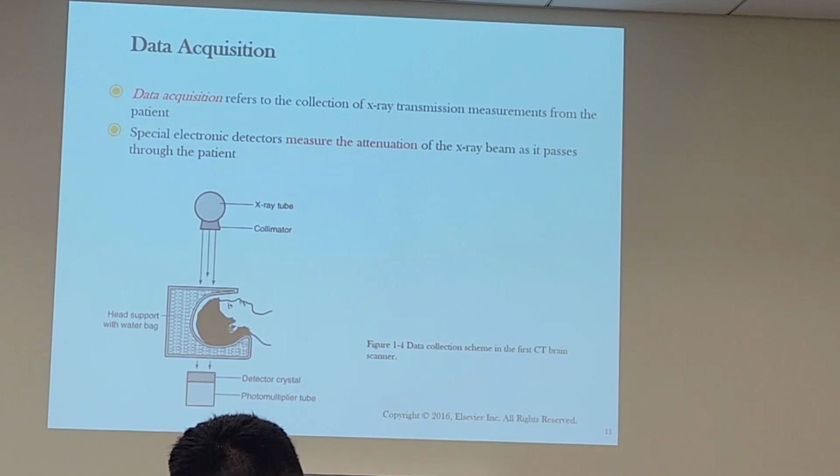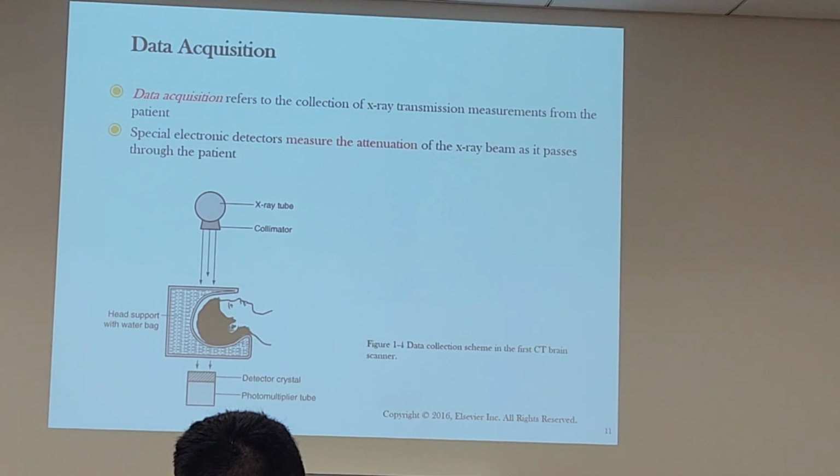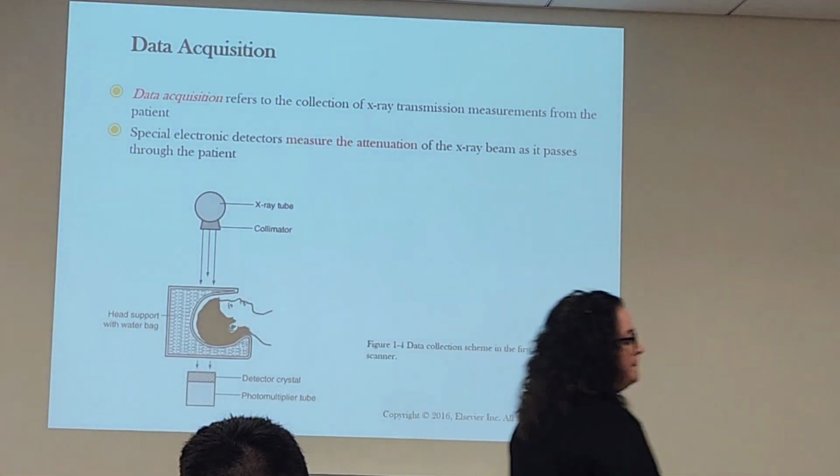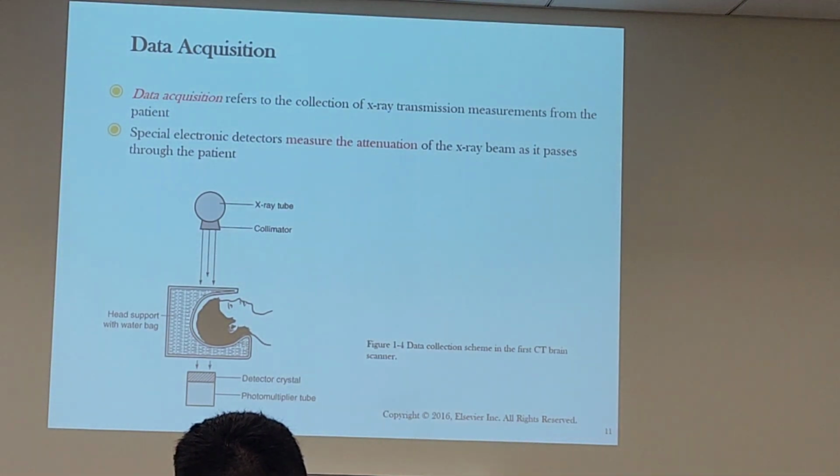So is the detector going to capture a large amount of X-ray here? No, it's going to be very low. But here we have neck, not that much bone, maybe also tissue. So the energy is going to be higher here. Attenuation is just how the X-ray is moving through the body and how some of it is being absorbed and some of it is not. Some of it is landing on the image receptor, but here it's called the what? Detector. In CT, we're talking about detectors. We're not running imaging plates, it's all a detector.